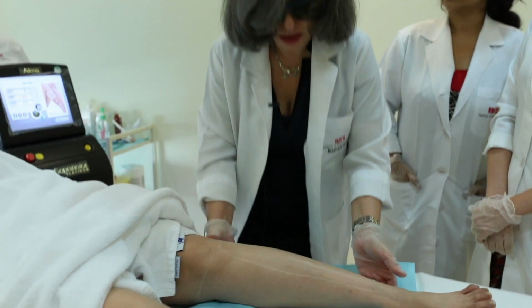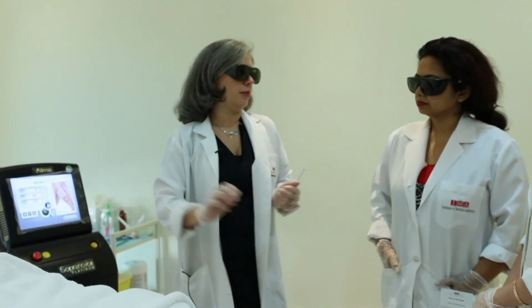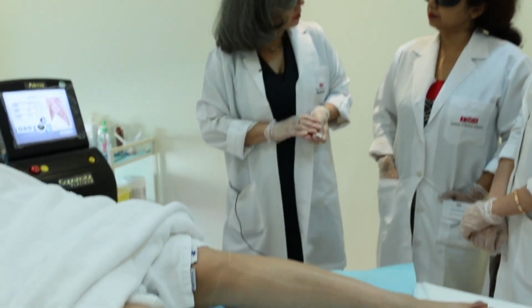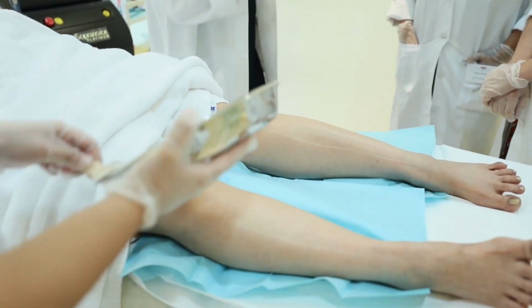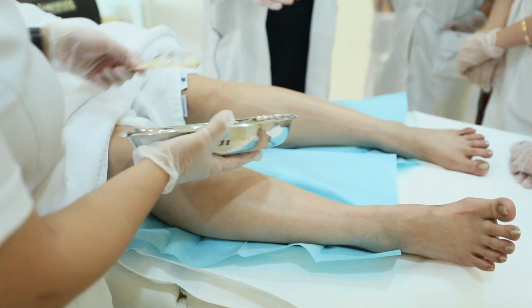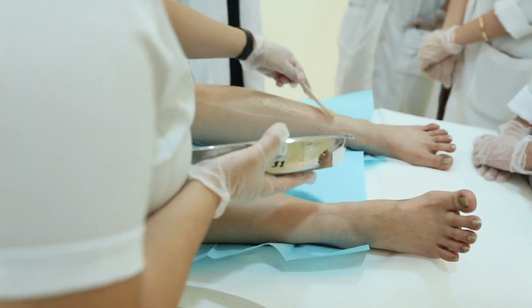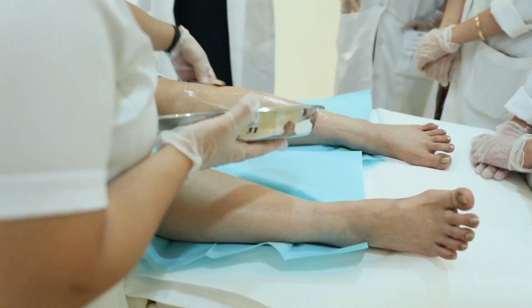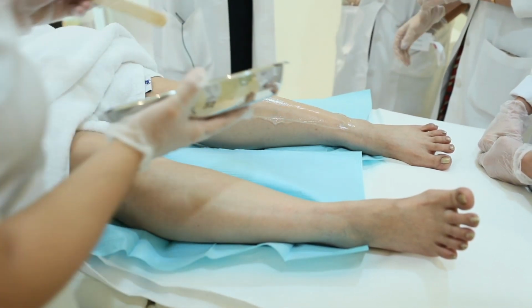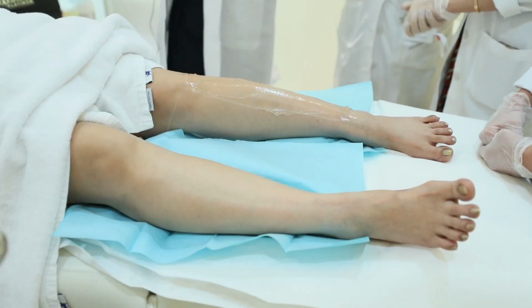Ms. Raquel, can you come a little bit more forward to me? Very good. For this device, we need a gel because now we are going to do an in-motion laser. So we will apply the gel. Your gel doesn't need to be a refrigerated gel. Already in these kinds of environments with AC, it's a bit cold, sorry. According to the rules of the HCC, we have to have gloves on when we are touching the patient. I will start for 10 seconds, just showing you how you have to do. Then you one by one will come and continue the treatment.